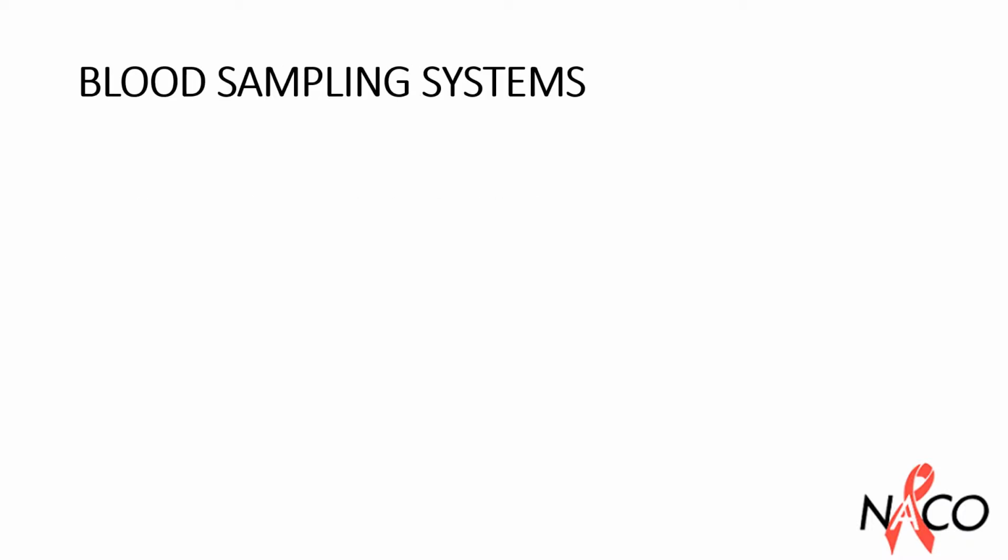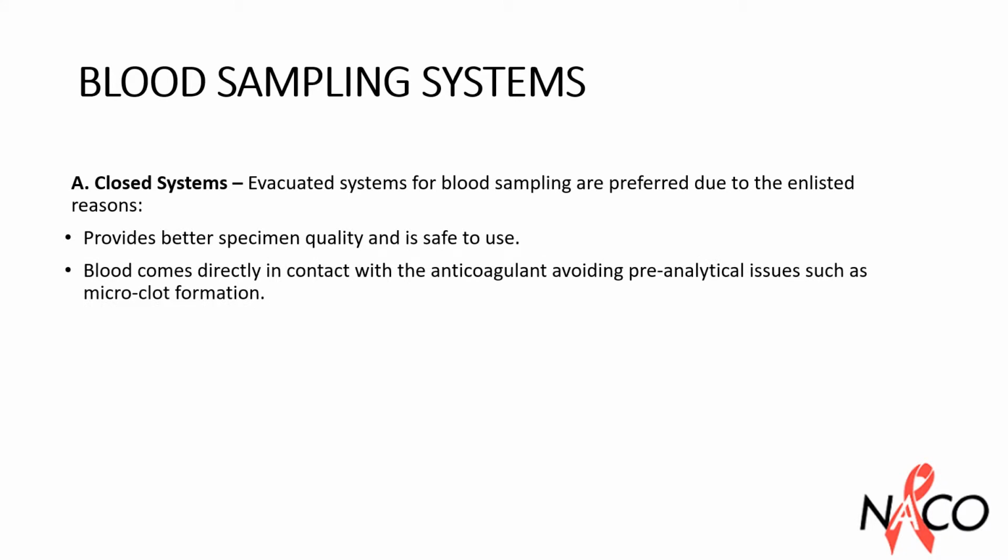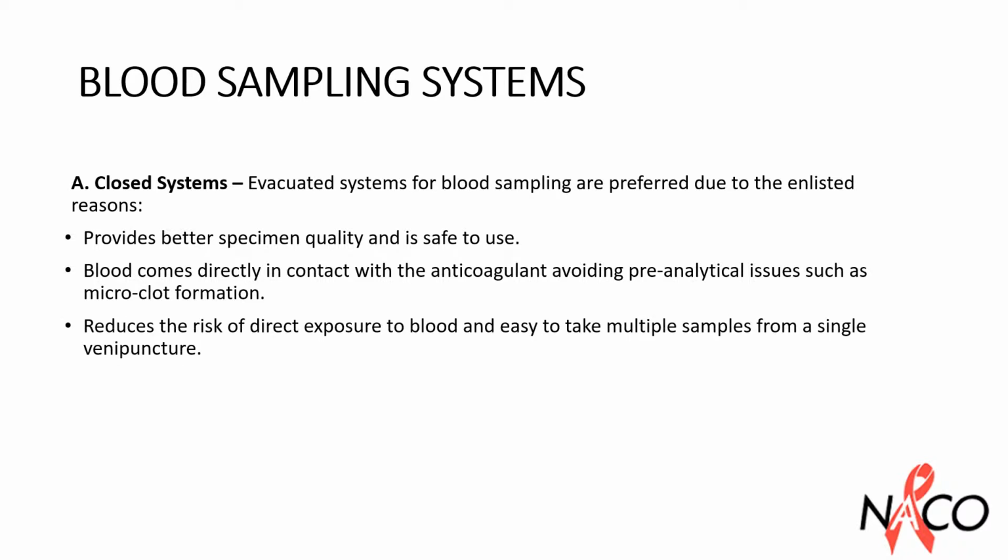Blood sampling systems can be of two types, open and closed. Closed or evacuated systems for blood sampling are preferable because they have been proven to be safer than open systems and provide better specimen quality. The added advantage of using closed system is that blood comes directly in contact with the anticoagulant, avoiding many pre-analytical issues such as microclot formation. They also reduce the risk of direct exposure to blood and make it easy to take multiple samples from a single venipuncture.